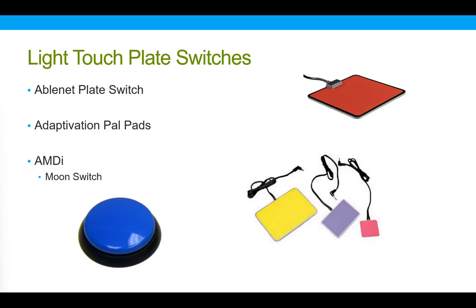Adaptivation also has the PAL pads, and those are pictured in the middle here. They come in different sizes, also very low profile switch. And then AMDI has their moon switch, a little higher to get up and over the edge of this, but very sensitive.